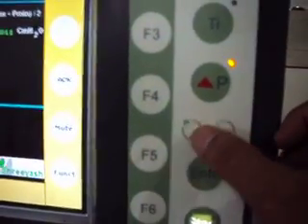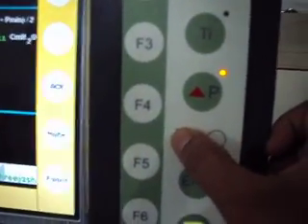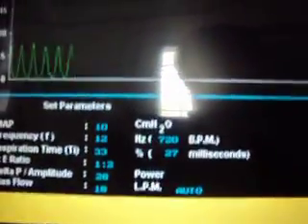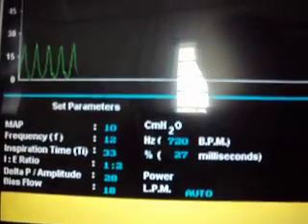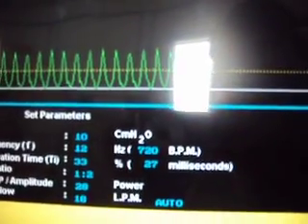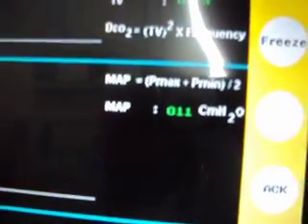Let us try another scenario. Suppose I change the delta P. The delta P was at 25; I want the delta P to be at 28. I increased it and pressed enter. The power has increased. However, as you can see here, the mean airway pressure has remained the same.